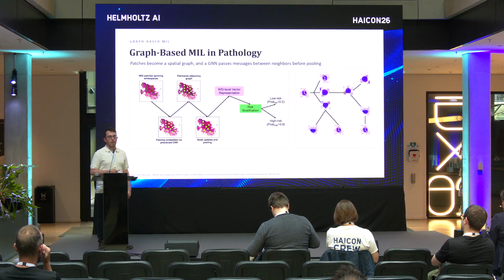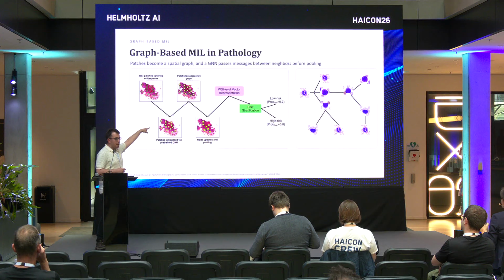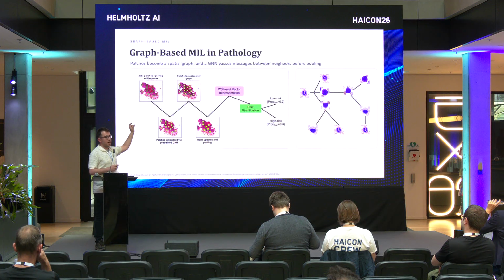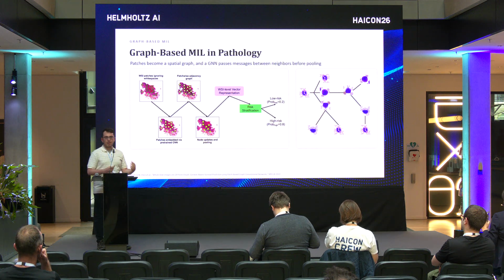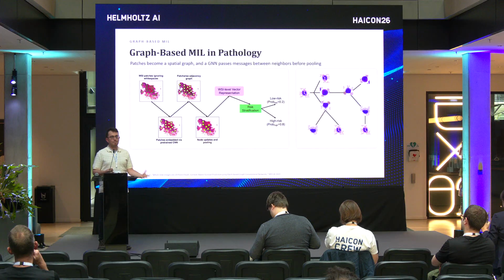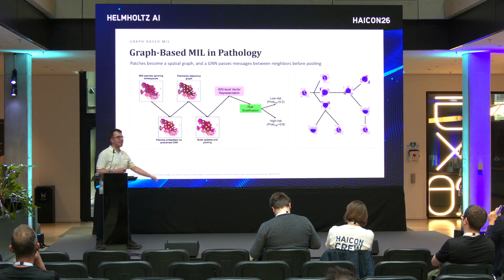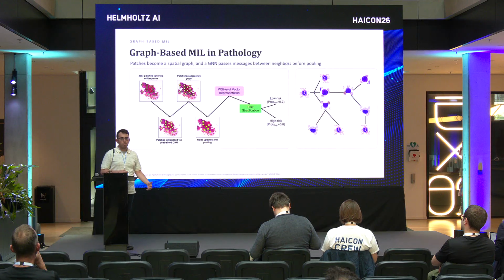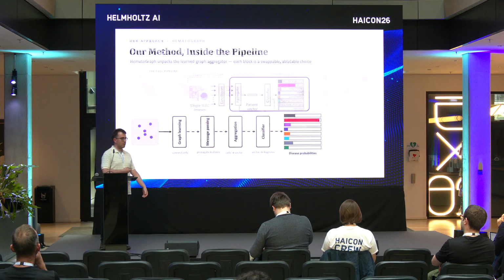Actually, graph neural networks have been explored widely in pathology. They patchify the image, and then they build the graph based on the spatial connections between the patches. But in hematology, we do not have this spatial relationship, because when you give your blood, it's just a mixture. There isn't any special location on the slide. Therefore, you cannot build such a graph, similar to the right side, very simply. Therefore, you also have to learn the graph end-to-end if you want to use graph-based classification or graph-based aggregation.